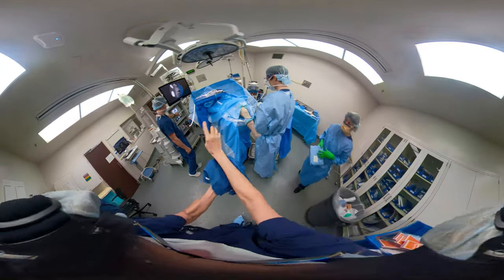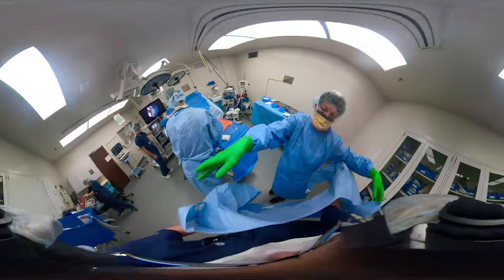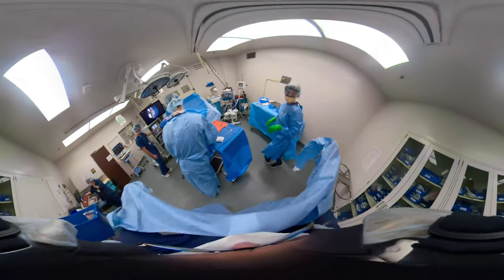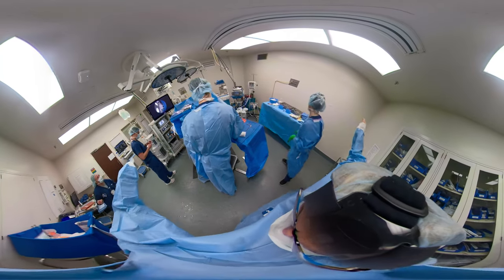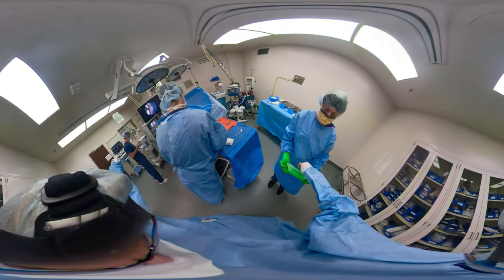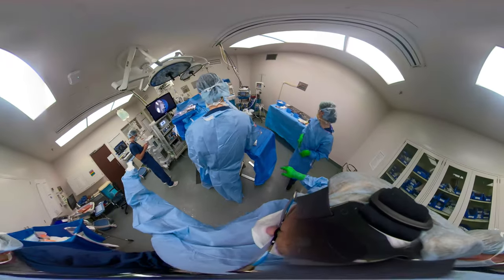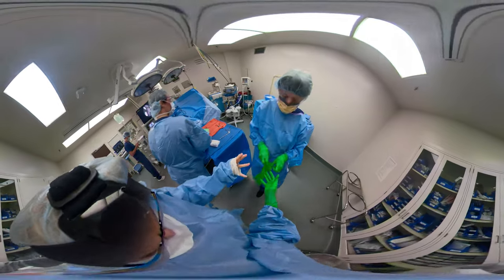We're doing a time-out. This is a left knee arthroscopy. Everybody needs to pay attention during the time-out. Left knee — a very important part of the procedure.